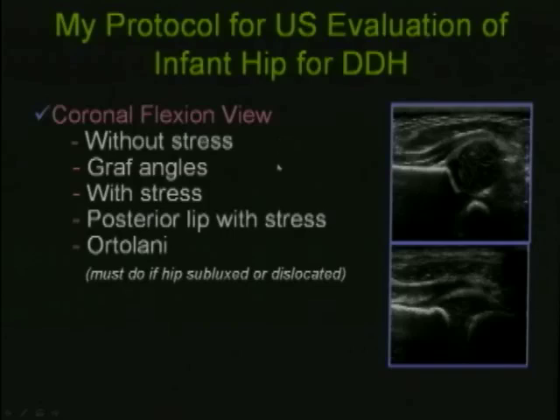I measure the graph angles. I do it with stress. I do a posterior lip view with stress. I do the Ortolani, which you really must do if the hip is subluxed or dislocated.